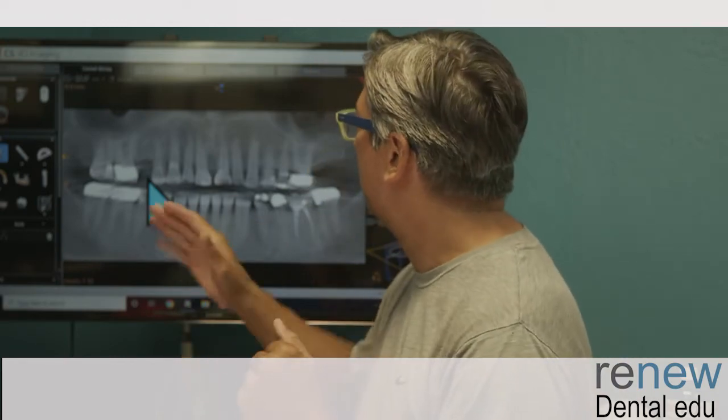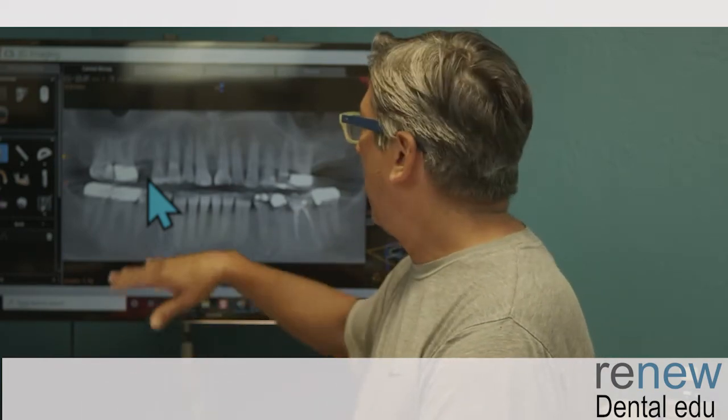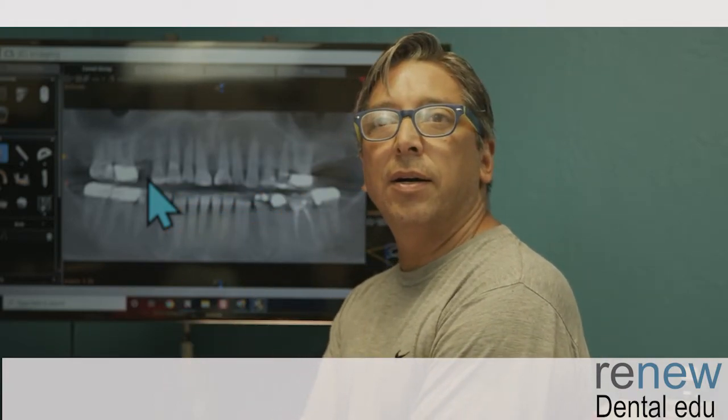The reason why I call it Another Monster is because there's so many of them out there that have these characteristics where they have a collapsed bite starting. So it's kind of an interesting thing. We're going to do follow-up cases with this one, and you'll want to keep track of this one because he only has one implant here, but I see a root canal treated tooth here and all the other kind of dentistry that he does. The other thing I don't have on my treatment assessment is tori.